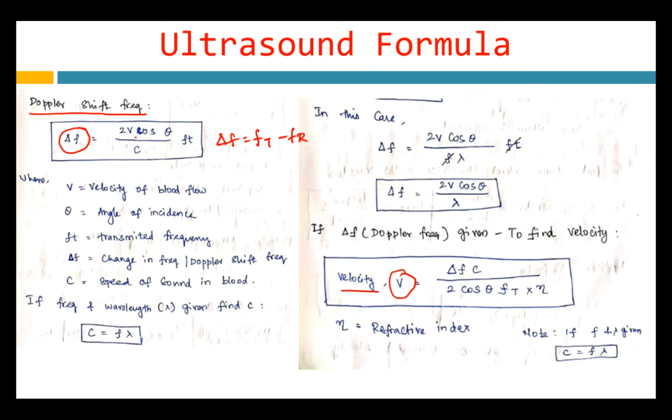That is why I said in ultrasound there are 3-4 parent formulas. From the parent formula you can substitute and derive daughter formulas. Okay, this is one of the most important formulas you should know in your BMI laboratory. We calculate using this formula. If you want to know ultrasound, you must know this. The image is formed in our ultrasound using this. So definitely when you go for an interview, they'll ask you to write the Doppler shift formula, the expression for Doppler shift.